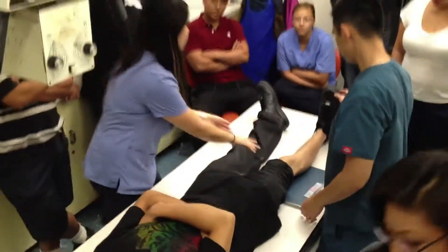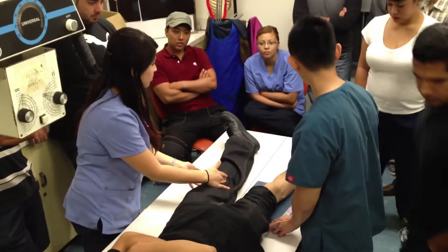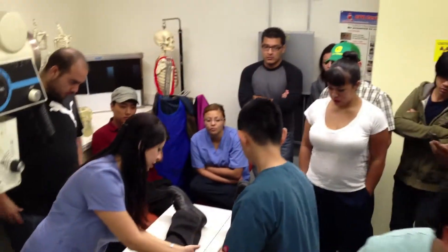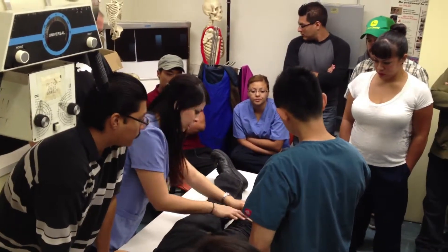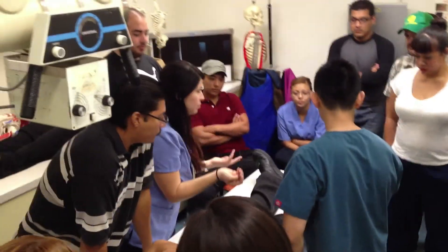For the AP knee, the body's normal response is to kind of lay out like that. What he's doing is centering the patella. The CR is going to come a little bit below — the book says two inches, but I do about an inch below. I use Bucky.